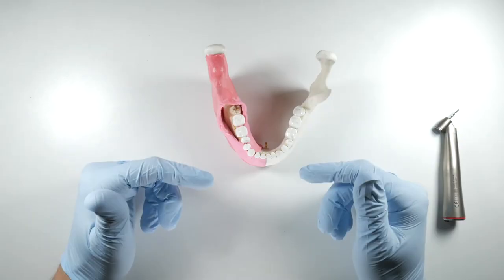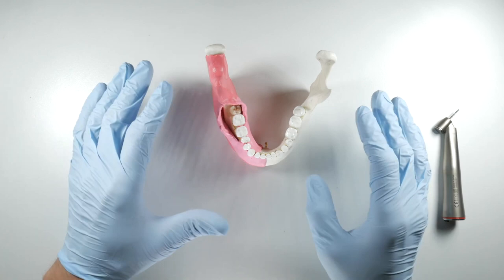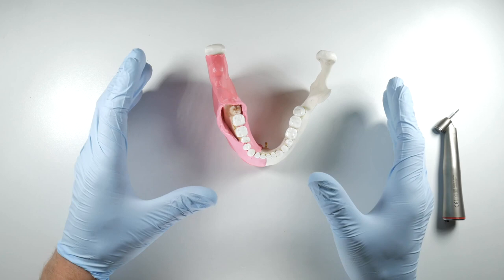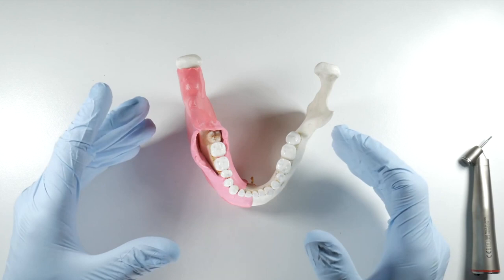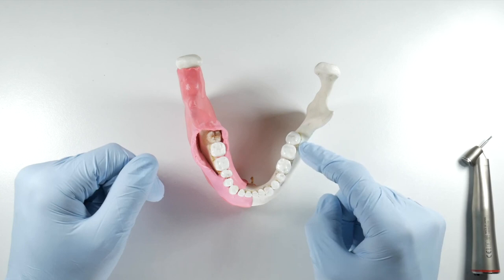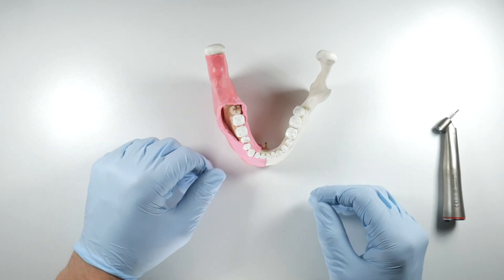Anytime you pick up a handpiece with the intention of removing bone around a tooth, you need to have a plan and understand why you're removing that bone — be very deliberate. Removing bone should make the extraction faster or easier. Don't just start blasting bone away. Anytime you're looking at removing bone versus sacrificing tooth, err on the side of sectioning the tooth versus taking away more bone. We don't want to weaken the mandible too much — it's a functional bone under heavy stress. Once you take the third molar out, you've opened a line of weakness, and if you take more bone away you could subject your patient to a post-operative fracture or even an intraoperative fracture.